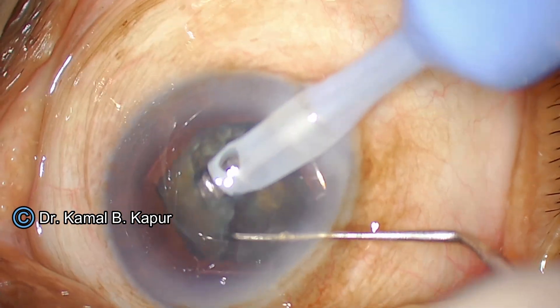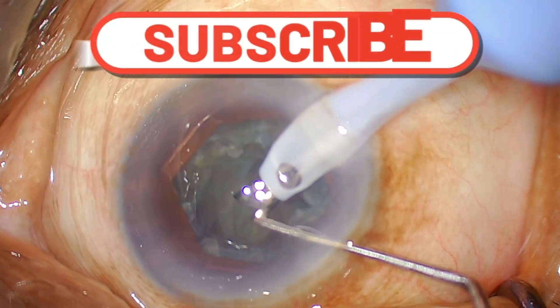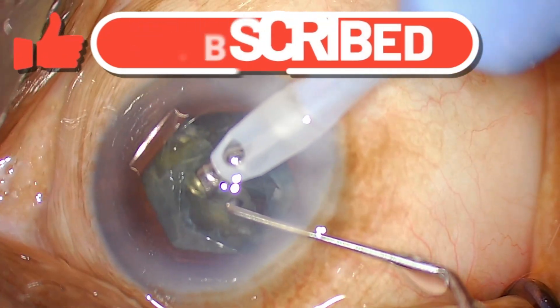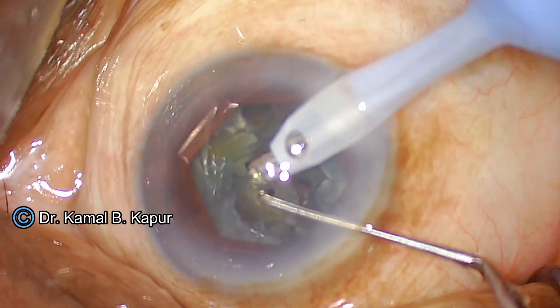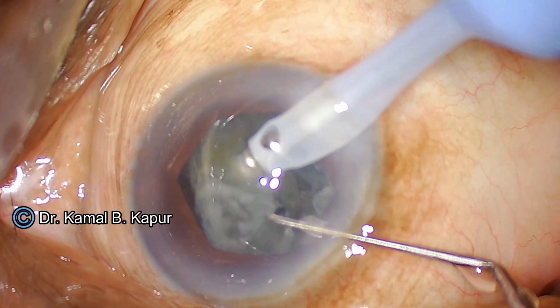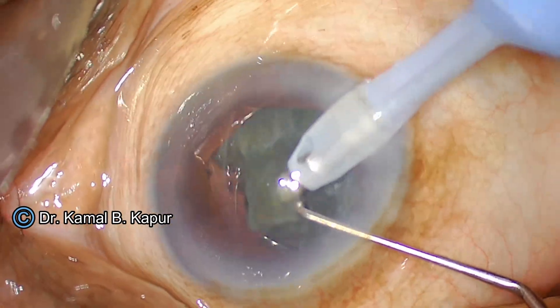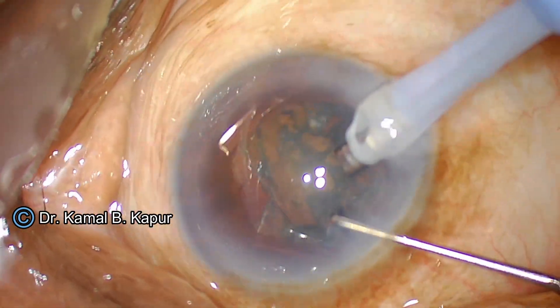This being a sticky and soft cataract is giving some trouble, but nevertheless I have created small wedges and will finally try to hold one of the wedges and flip the cataract into the anterior chamber. From now I will just fast forward the video — you will see I have managed to flip the whole cataract into the anterior chamber and the cataract aspiration is nearly over.